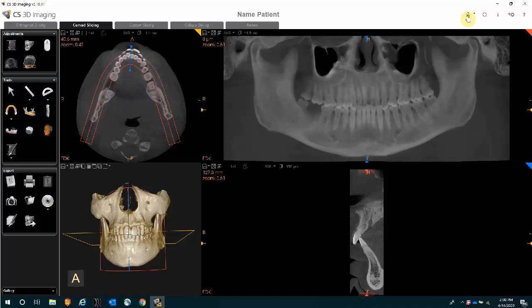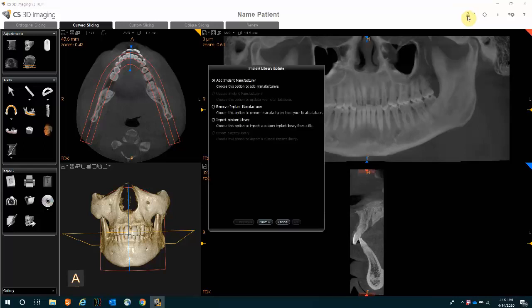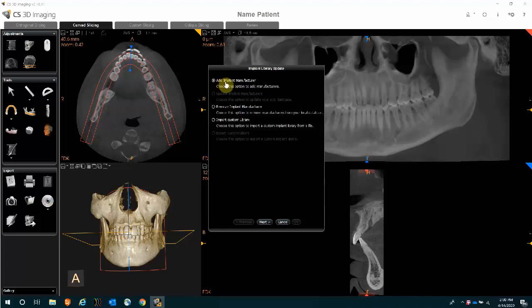By clicking on that tool, you will be given an option to add an implant manufacturer, remove an implant manufacturer, or import your own custom library. If you're looking to add an implant manufacturer, that option is selected as a default.